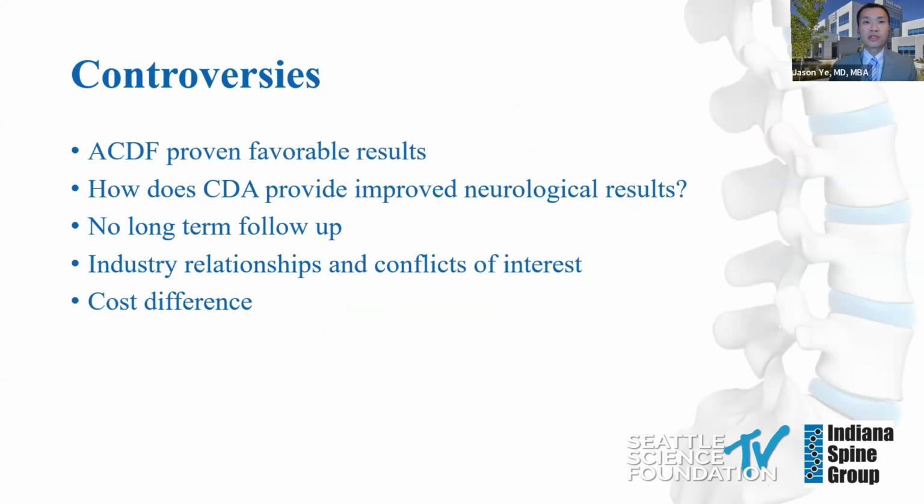As IDE trials came out with their data, several questions arose. ACDF had an excellent record. To improve upon that would be difficult. Furthermore, unlike in the hip or knee, where motion of the implant dramatically improves the function of the operating joint, a single level ACDF has little perceptible effect on the overall range of motion of the neck. The benefit for cervical arthroplasty is at the adjacent level as opposed to at the index level.